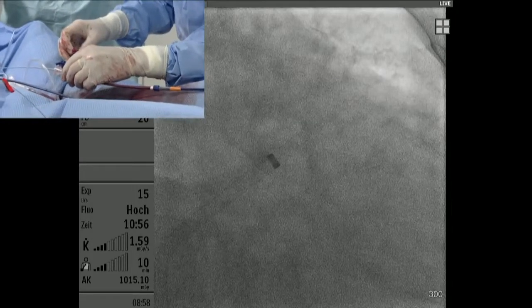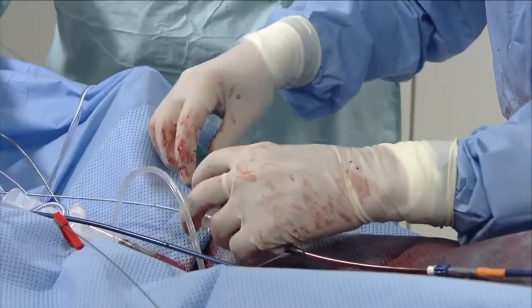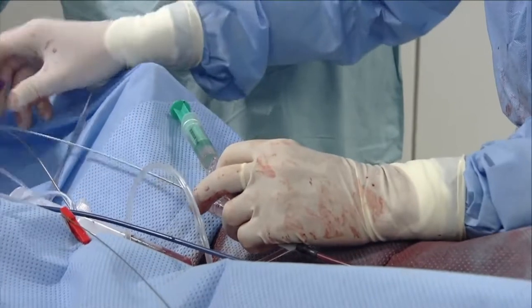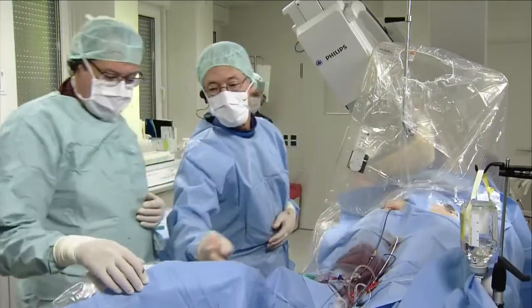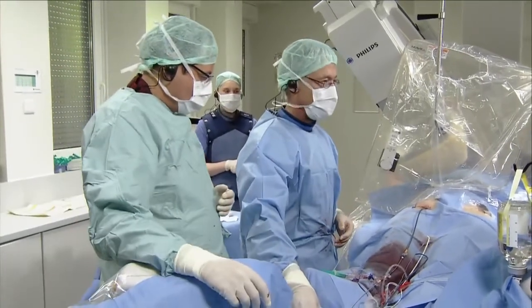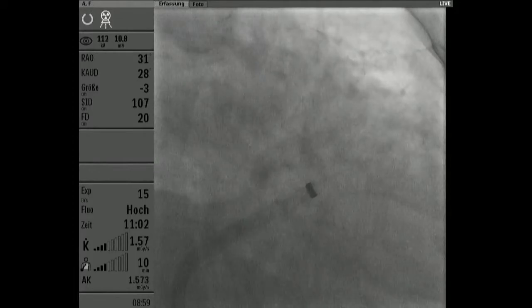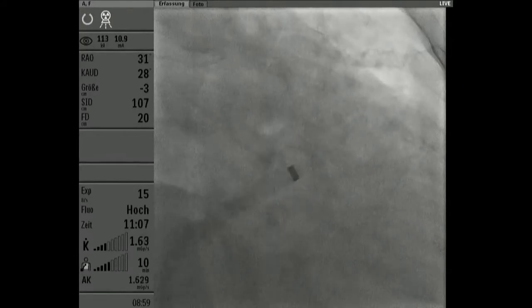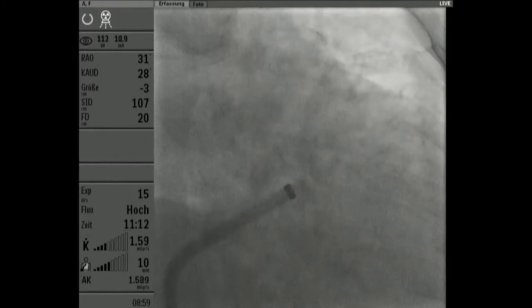Just de-airing again. So, Jaiwan, which of the sizes of the Lifetech device would you choose? Yeah, the special sizes, small umbrella and big disc. The 1832 or 2032, the 18 and 20 have the same 32 disc on them. Mm-hmm. Certainly a bigger choice.